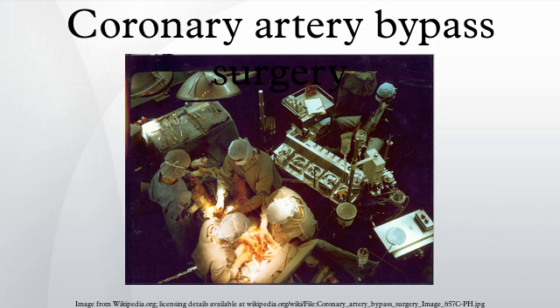Arterial grafts are far more sensitive to rough handling than the saphenous veins and may go into spasm if handled improperly. Generally the best patency rates are achieved with the in situ left internal thoracic artery with the distal end being anastomosed with a coronary artery. Lesser patency rates can be expected with radial artery grafts and free internal thoracic artery grafts. Saphenous vein grafts have worse patency rates, but are more available, as the patients can have multiple segments of the saphenous vein used to bypass different arteries.